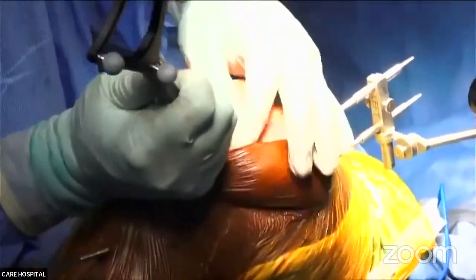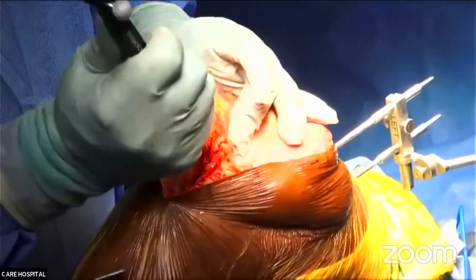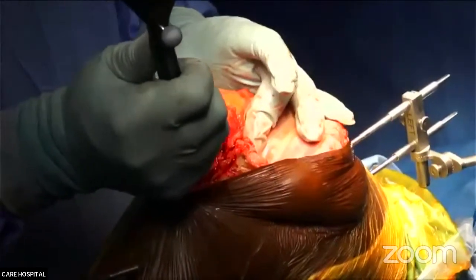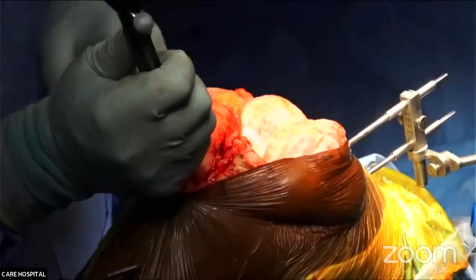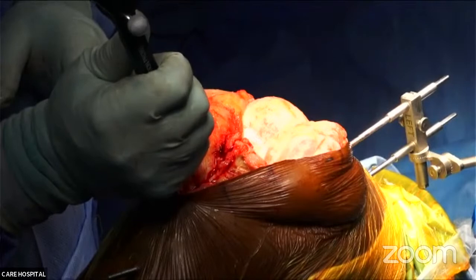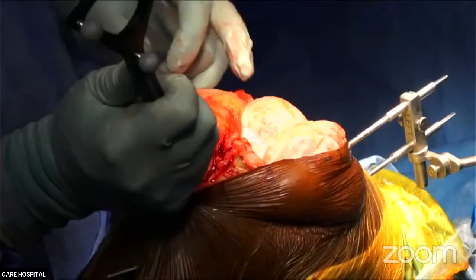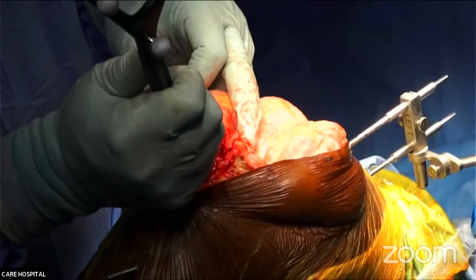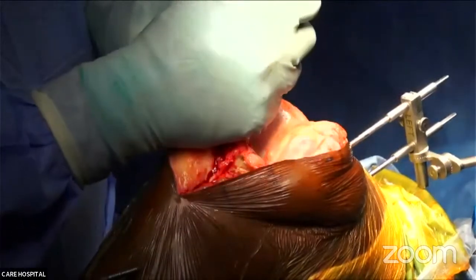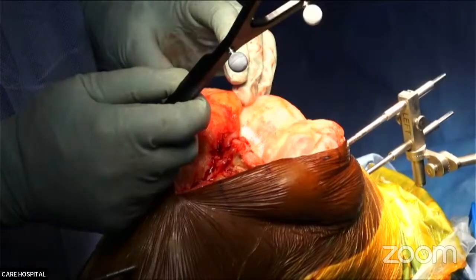The computer suggests which area you have to take 10 points in, like medial, lateral. Total 4 areas are there, total 40 points, 10 points in each area. Those 10 points have to be a minimum of 1-2 millimeters apart. Otherwise, if it is too close, it will not accept that. And on the tibia, these points have to be on bone. So you have to pierce with the stylus on the bone. You have to pierce the patellar tendon. You have to pierce the soft tissues so that they reach the bone.